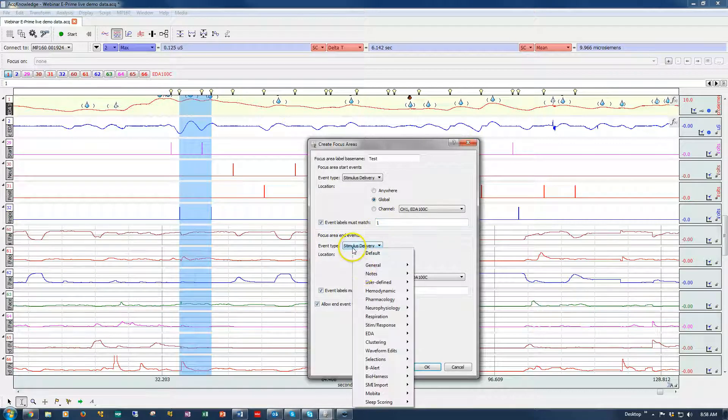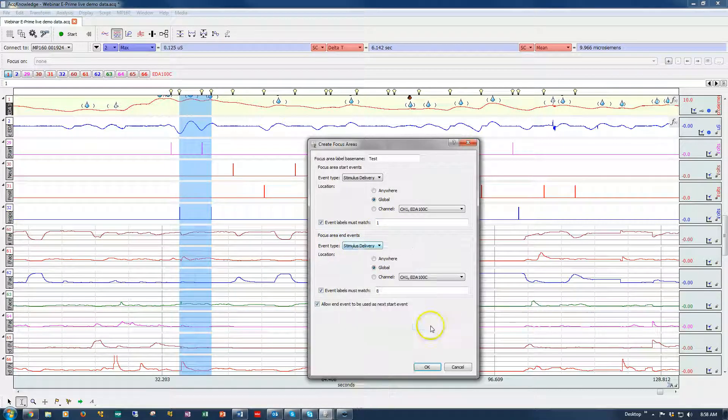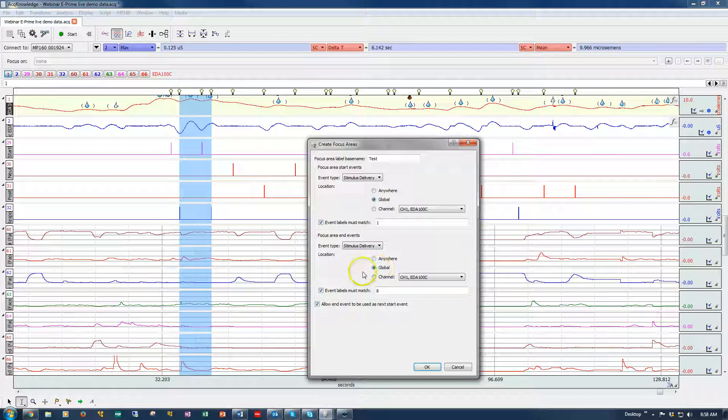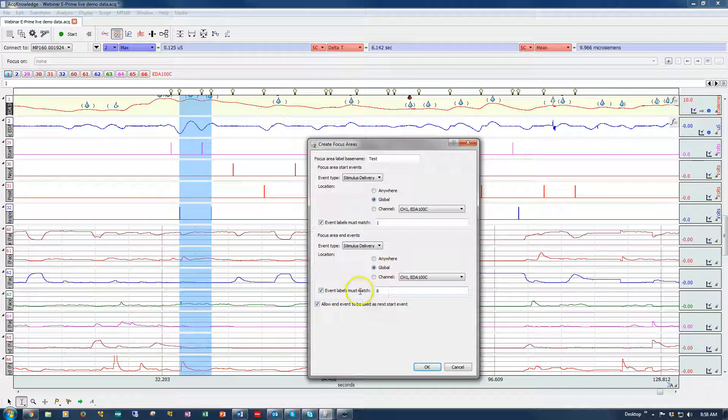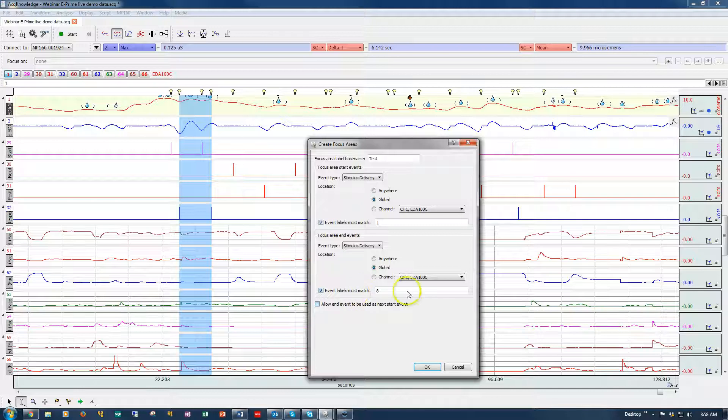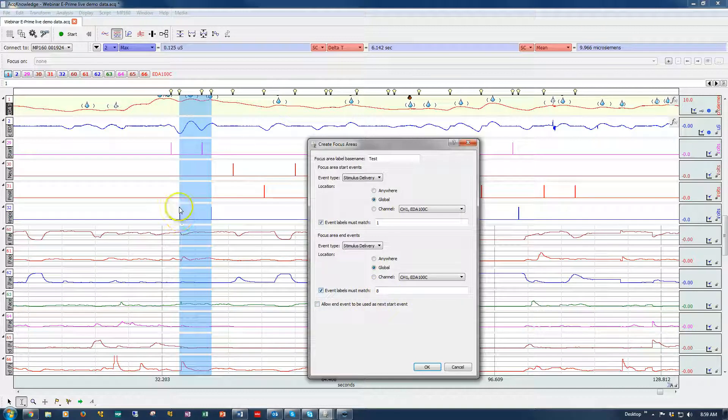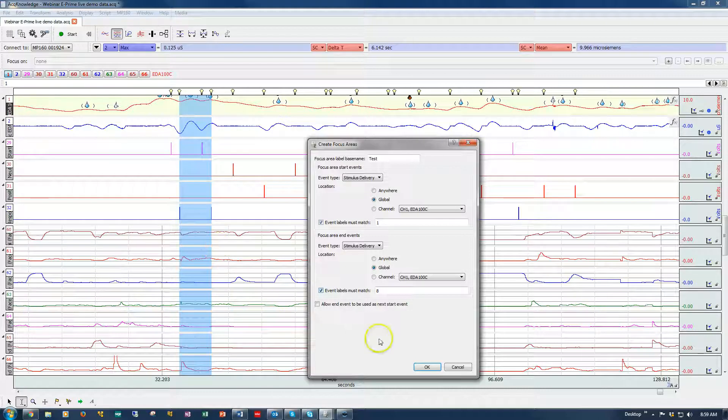So again, we're going to select stimulus delivery, the global bar, and it will be set to stimulus 8, type 8. That's this participant response down here. And I'll show you how to identify these in a moment.